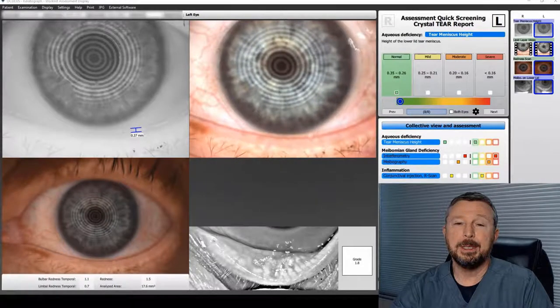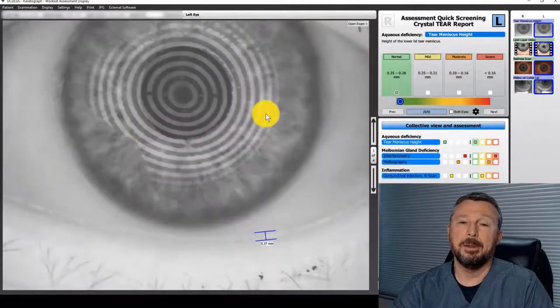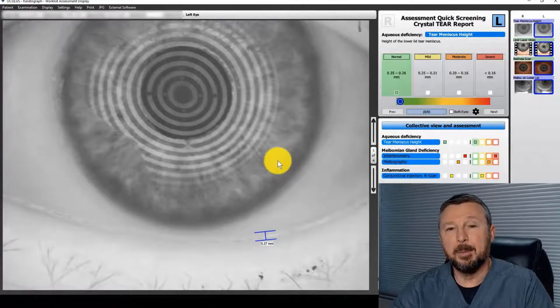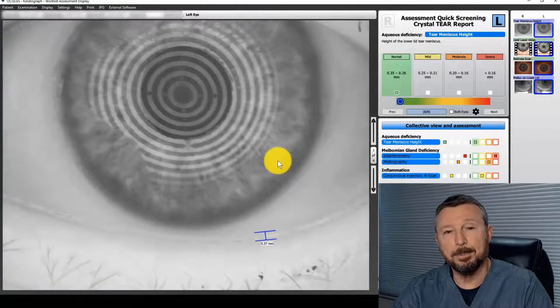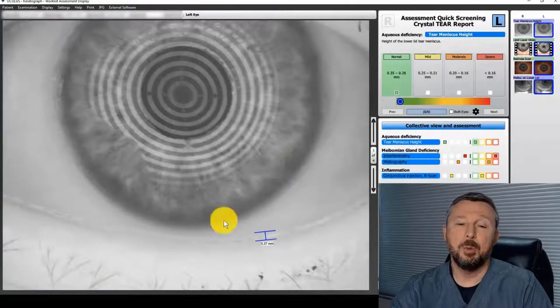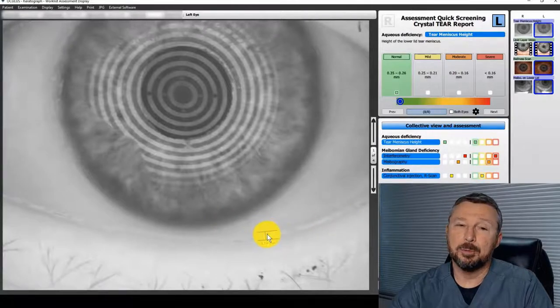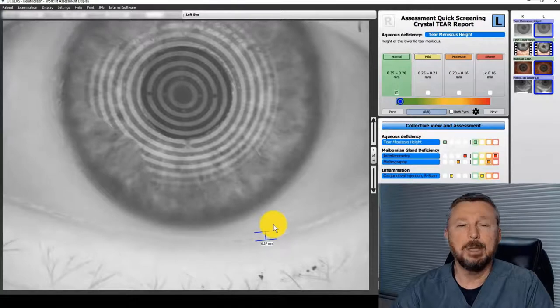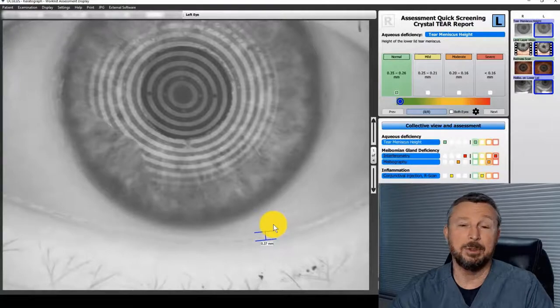Let's take a look at the scans of your tear layer. First, we're going to look at the volume of tears in your eyes. Your lower eyelid acts like a dam holding a reservoir of tears back up against the eye — I want to know the depth of that reservoir. Here you can see your tear reservoir. Yours is 0.37 millimeters deep. The normal range is 0.26 to 0.35 millimeters. So 0.37 is perhaps just a little more than expected, but really that's not a problem. You've got plenty of tears in your eye.